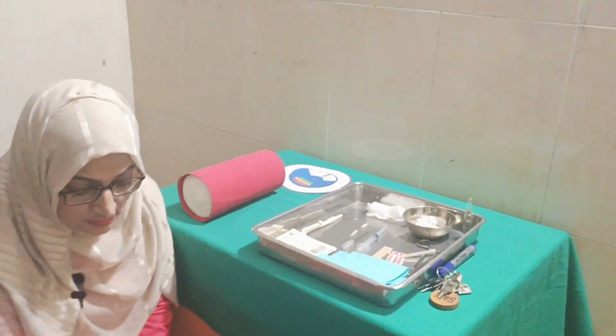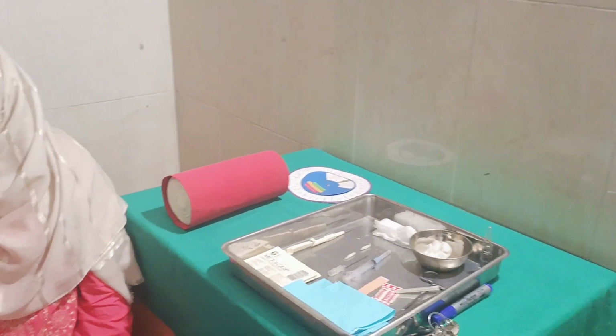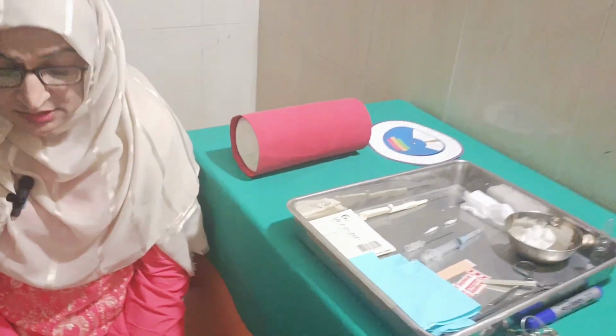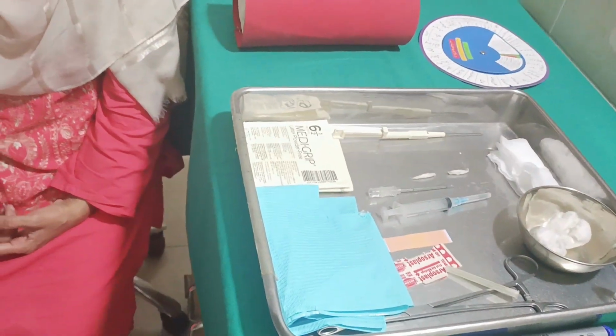If the patient has an IUCD, the implant should be placed immediately after the removal of the IUCD. If the mother is breastfeeding, then for the initial 7 days a barrier method or some other contraceptive method should be used, and pregnancy should be ruled out. So all these are the things about when this implant should be placed.